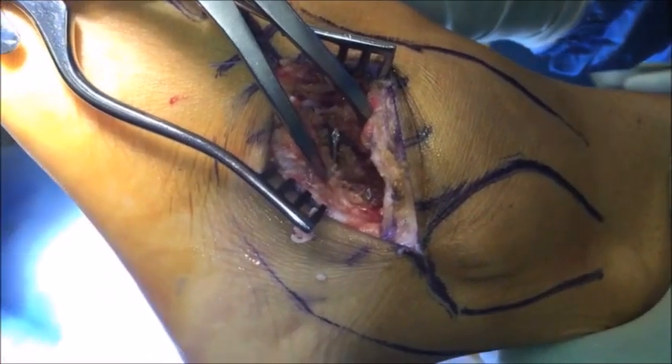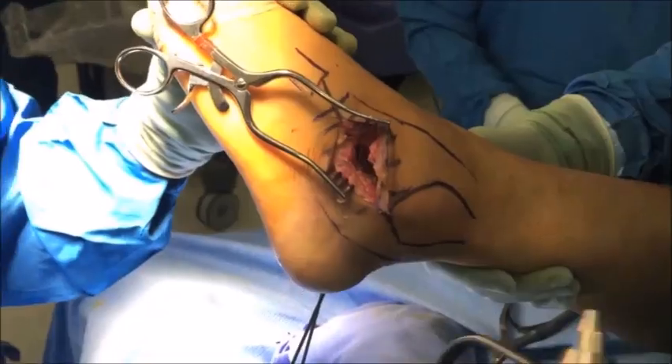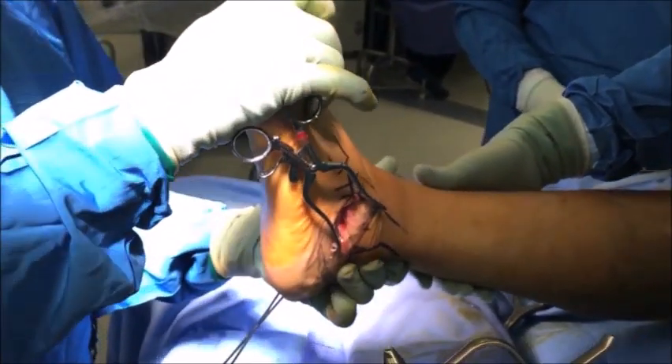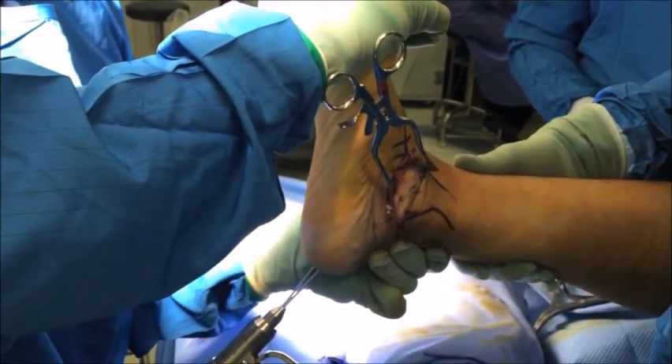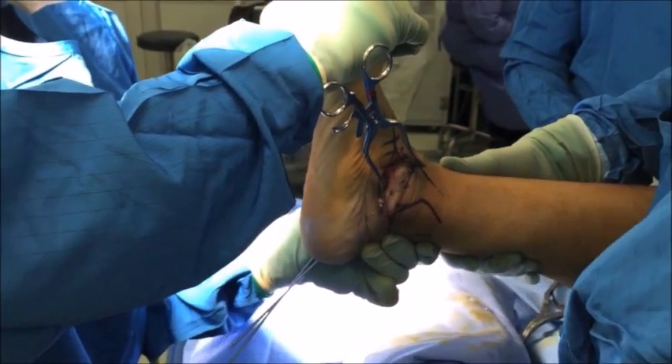Once you are happy with the position of your K-wires, the lamina spreader can be removed. The subtalar joint is then reduced — take your time in reducing the joint and make sure that it's in an anatomical position of approximately five to ten degrees of valgus. Once you're happy with the reduction, your assistant can drive the K-wires up into the talus.